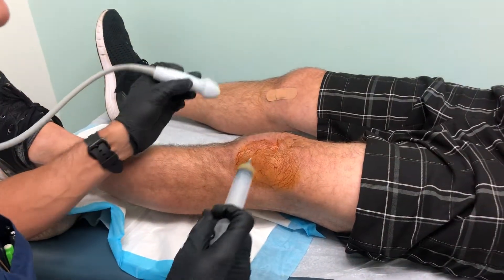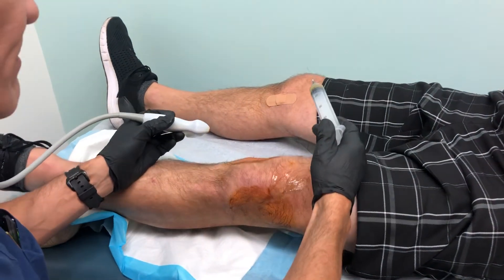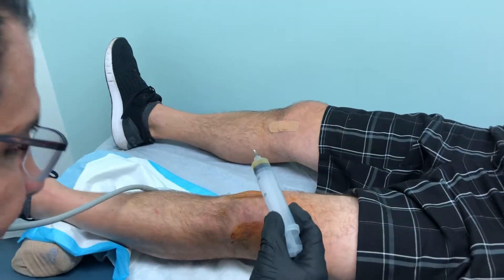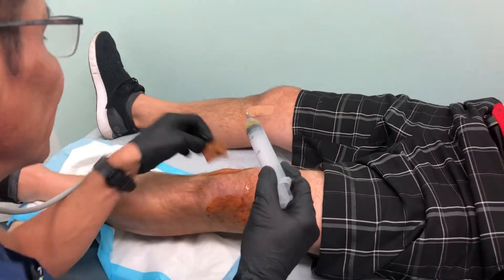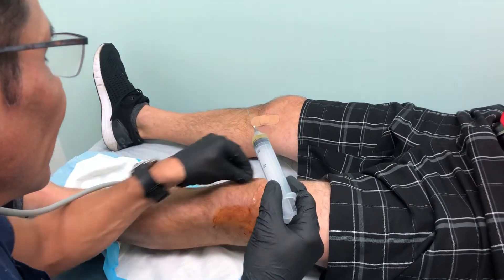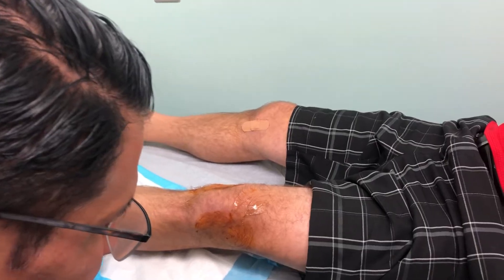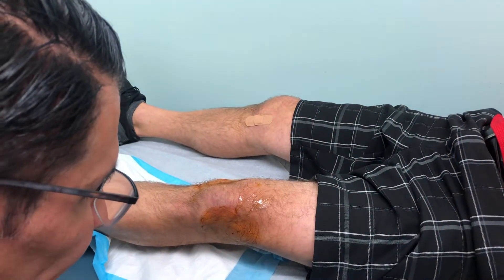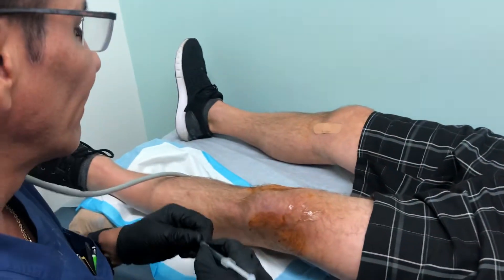As soon as he stands up, it's going to rain down towards the joint surface. Now I'm going to focus on the capsule. This is where I really need the ultrasound because I need to make sure I get it in the right spot. Before I do this, I'm actually going to cap this back up and inject a little bit more local because I know it's a tender spot.